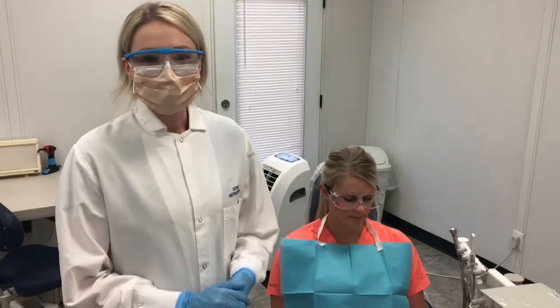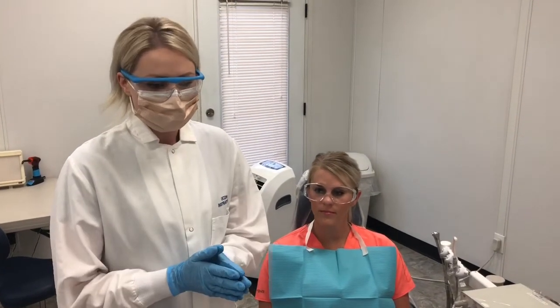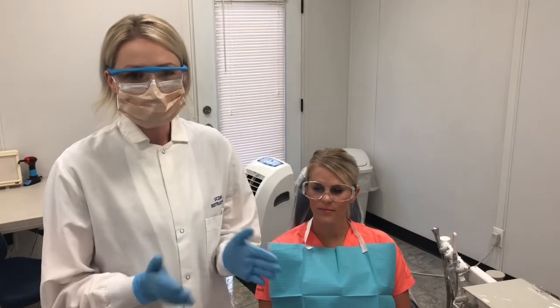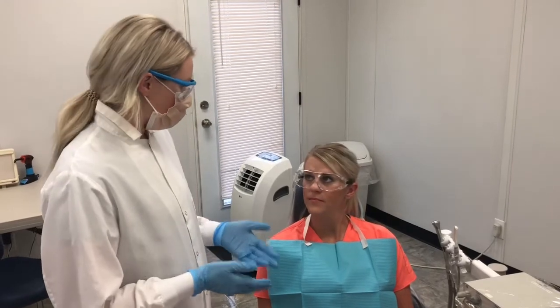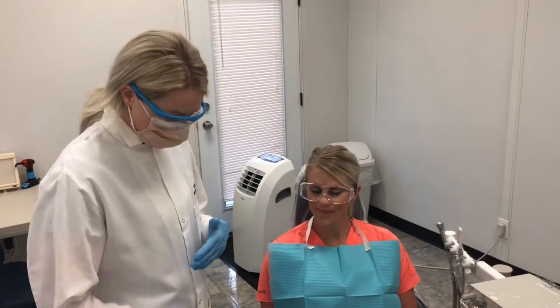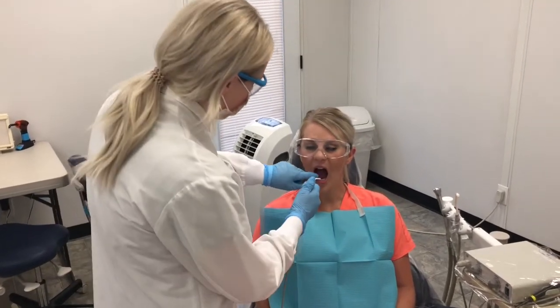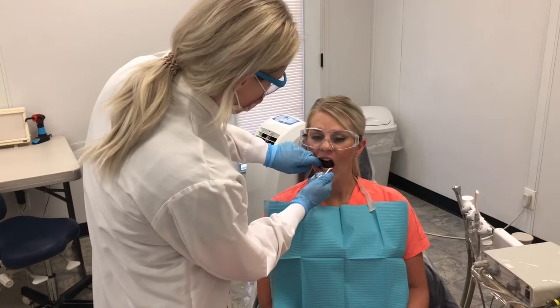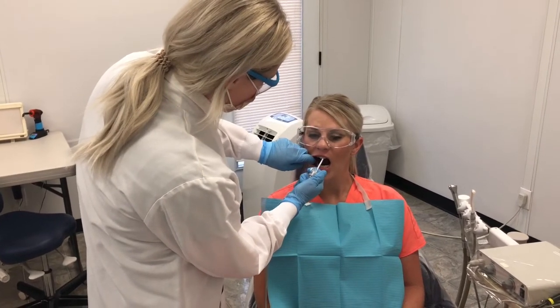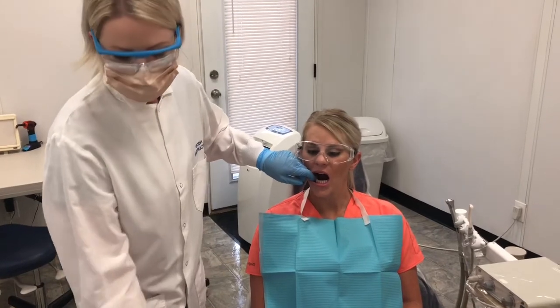Now, as you can see, I have put on my PPE and we're going to apply the fluoride tray. Ms. Reeve, I'm just going to have you swallow to remove any excess saliva from your mouth, and I'm going to dry off the teeth here. If the patient is too sensitive with the air, you can wipe off the teeth with gauze — that is an option.